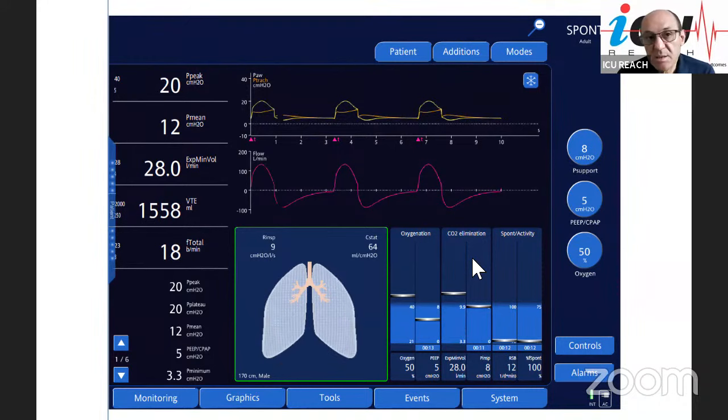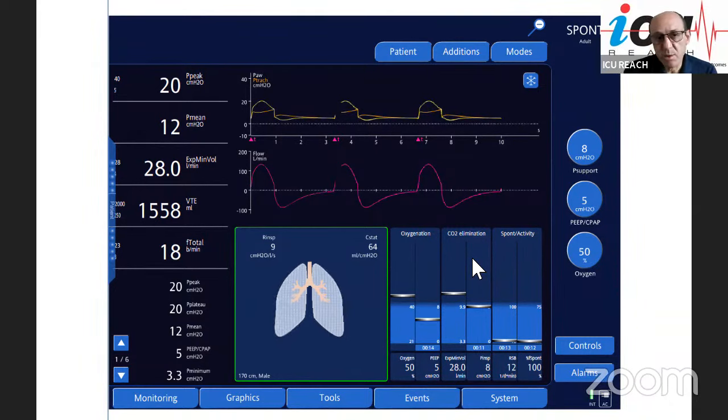What I would say is it is very physiological and it helps the patient. It chooses the pressure needed throughout inspiration in a more physiologic way, but it really doesn't affect the outcome, that you're going to extubate those patients faster, quicker, or that it's going to make the patient more comfortable.